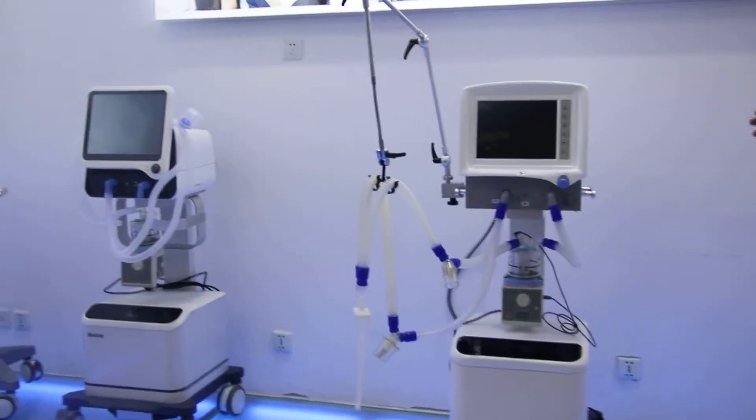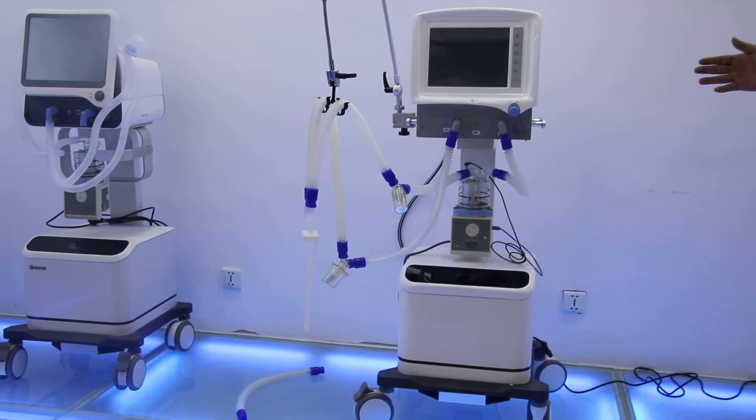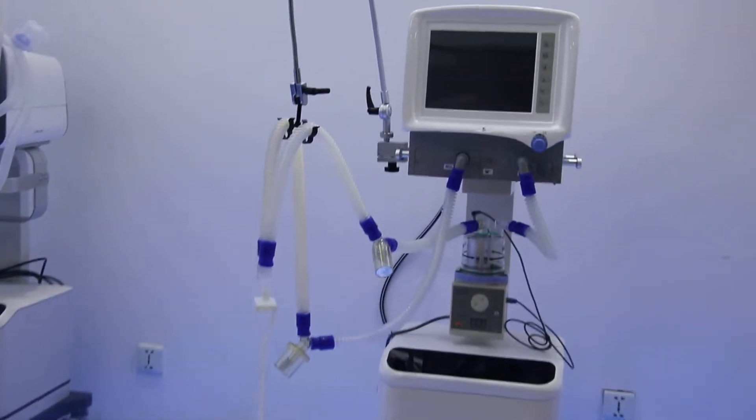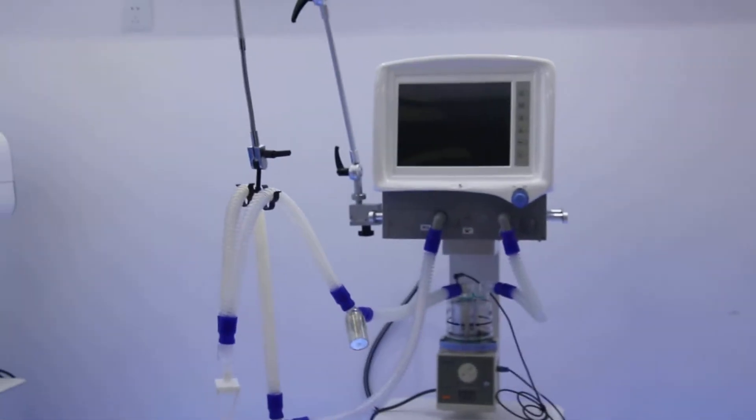Also we have the reusable pipe lock for adults and also for children. If you want to use it for neonatal, we have the spare parts for you. And then we have the breathing bag. Now let's turn on the machine and you can check the details.